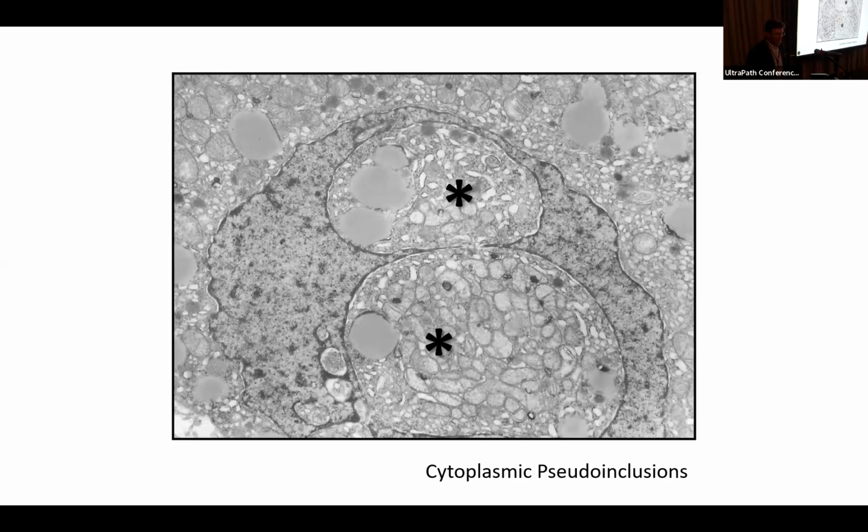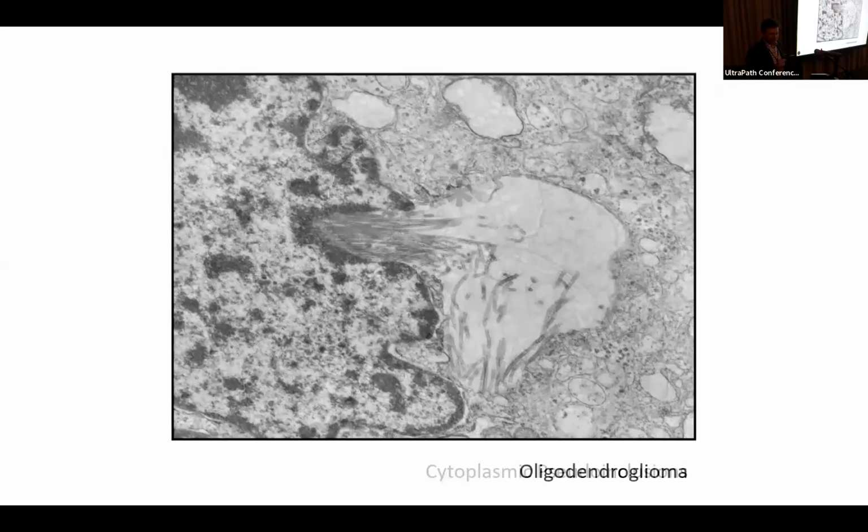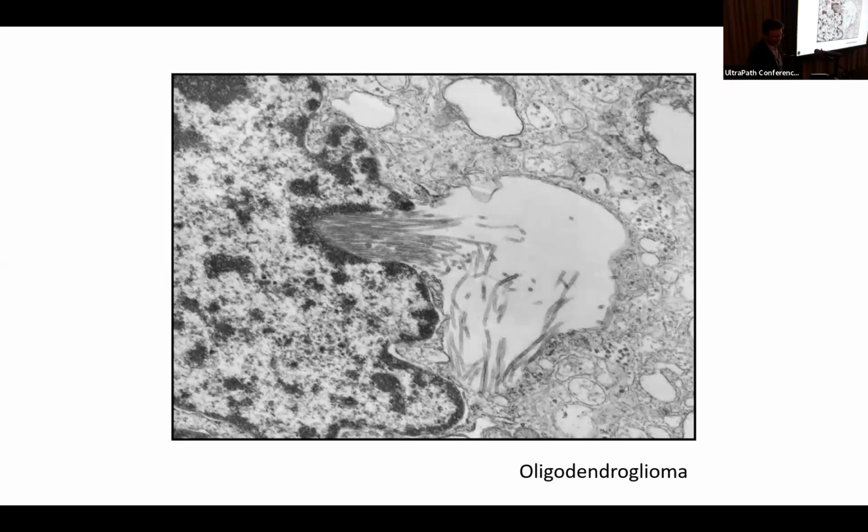Well, despite its appearance, the nucleus is actually quite liquid in its consistency. And often, especially in tumor cells and cells that are in motion, the nucleus can be deformed by portions of the denser surrounding cytoplasm. And these cytoplasmic pseudo-inclusions may provide a moment of concern when they're first encountered, but they're really not that important.